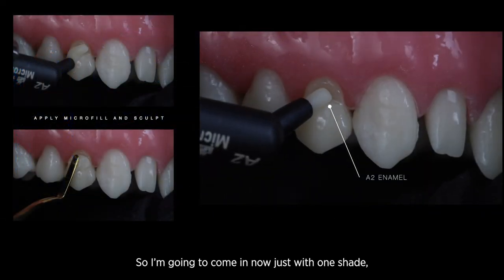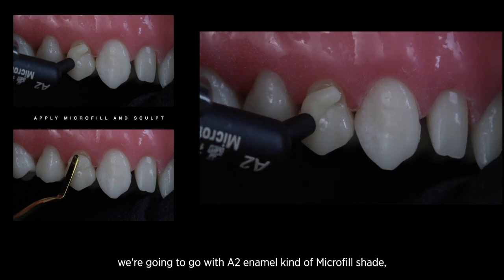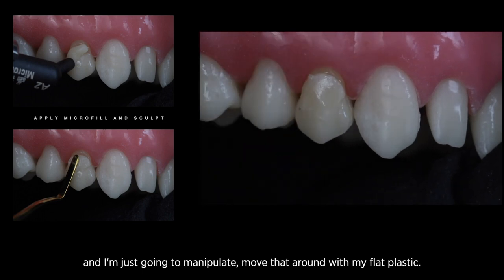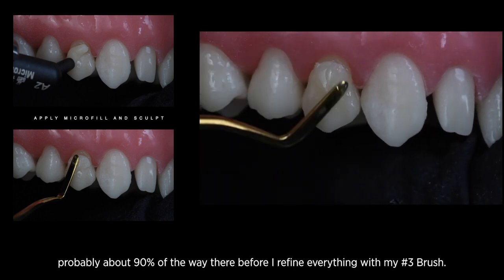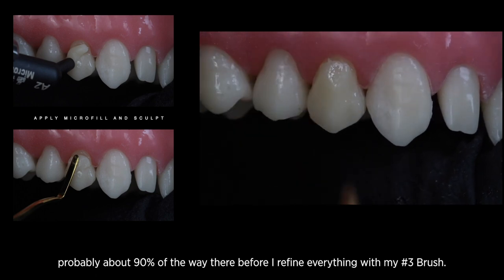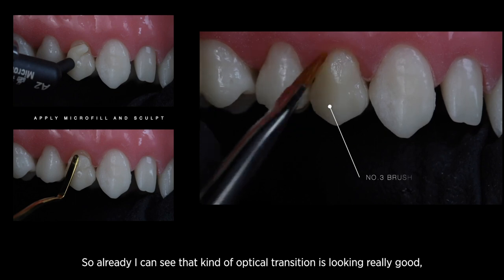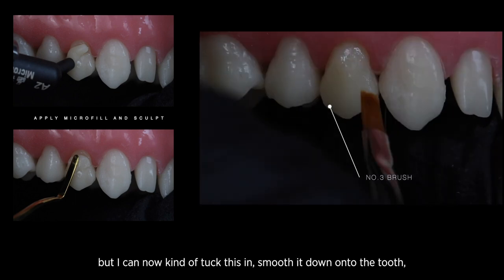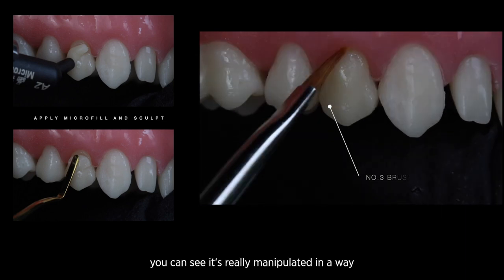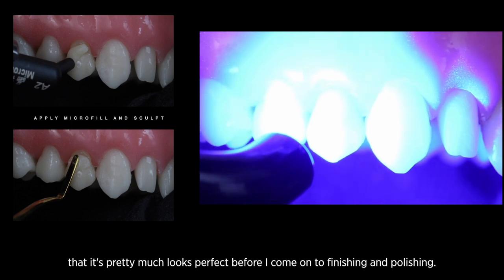We're going to come in with just one shade — the A2 enamel microfill — and I'm just going to manipulate and move that around with my flat plastic, getting it about 90% of the way there before refining everything with my number three brush. Already I can see the optical transition is looking really good. I can tuck this in and smooth it down onto the tooth — you can see it's been manipulated so that it looks pretty much perfect before finishing and polishing.